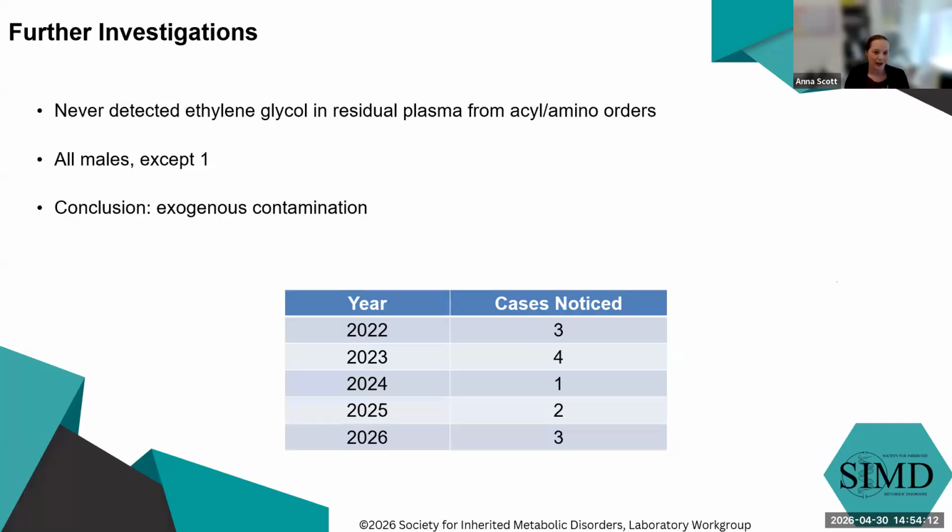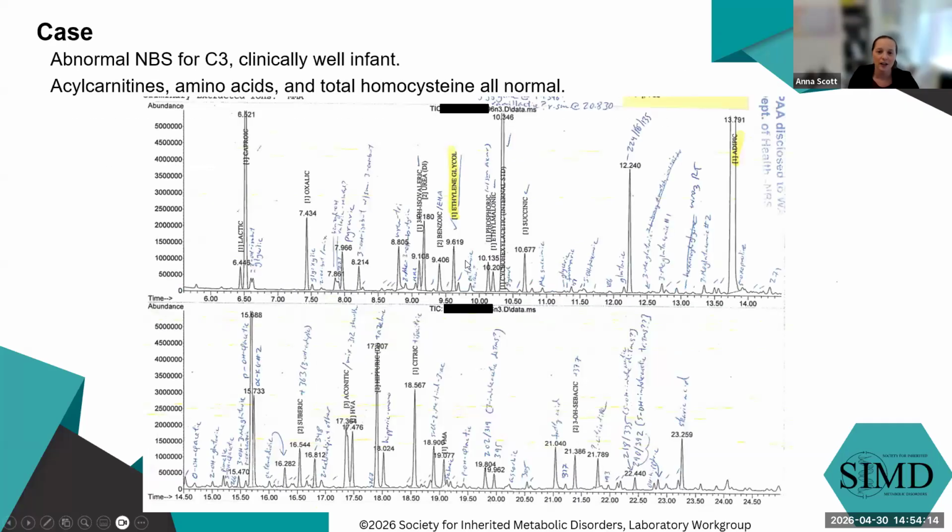And again, I've now seen this pattern. Here's our ethylene glycol peak. Notice totally normal lactic, normal glycolic, and this rather chunky, unusual adipic acid. If this were a school-aged kid, I'd be concerned they were eating a bunch of Jell-O. With a newborn, they're not eating Jell-O. This is coming from something else. And adipic acid is often used as an additive to lotions and things. It's easier on the hands and prevents drying out. So I haven't been able to pinpoint the manufacturer or what it is.